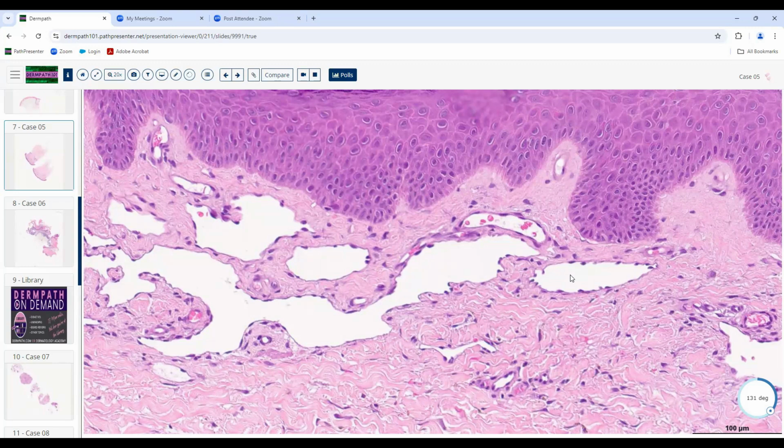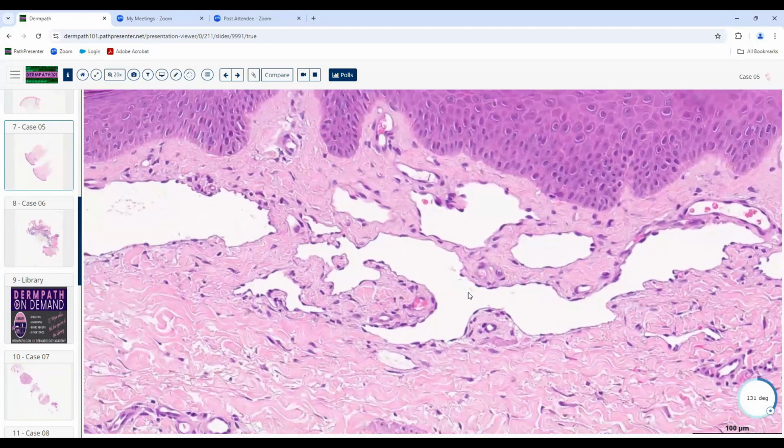That's classically seen with angiolymphoid hyperplasia with eosinophilia, and you'll often see eosinophils or even a pseudolymphomatous type of inflammation in those. You don't have to see that. Sometimes the eosinophilia is circulating eosinophils, but you'll see those large, thick-walled blood vessels. You have to have that almost every time to really make that diagnosis.